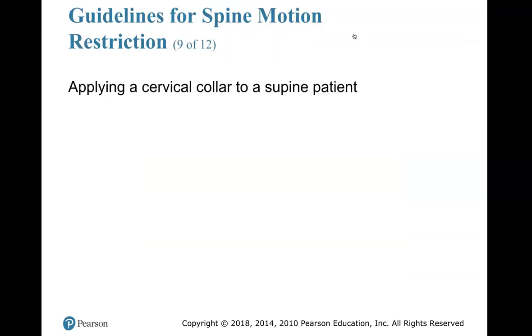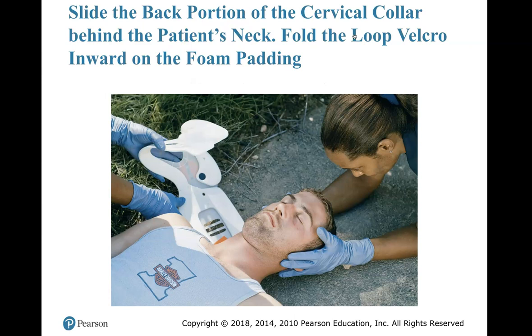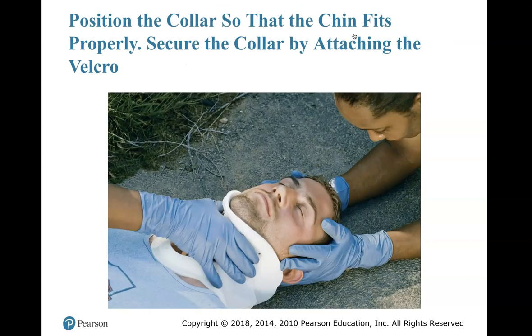All right, applying C-collar to the supine patient. Now we're going to slide that collar underneath them while someone is holding spine motion restriction. Please do not lift the patient's head off of the floor or the ground. You have just defeated the purpose.